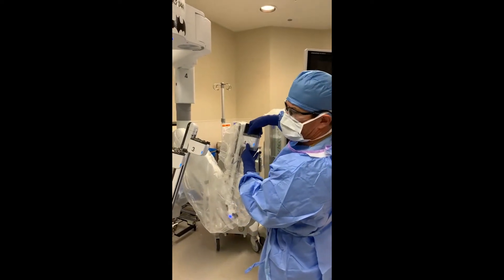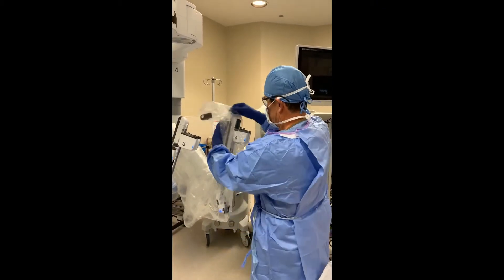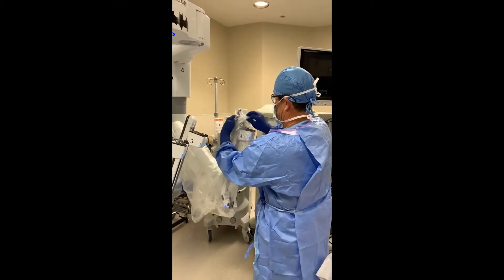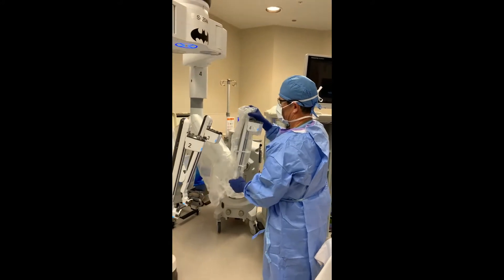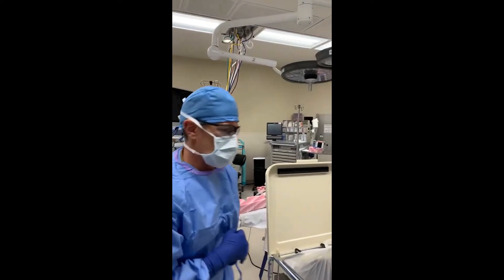Pop this on — it's going to make a noise, just like that. You know that's good. Pop that on, pop that on. One thing you can do is look at the monitor over there, and when that turns blue, it tells you that that arm is draped.